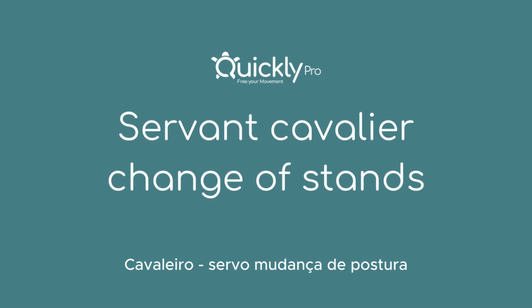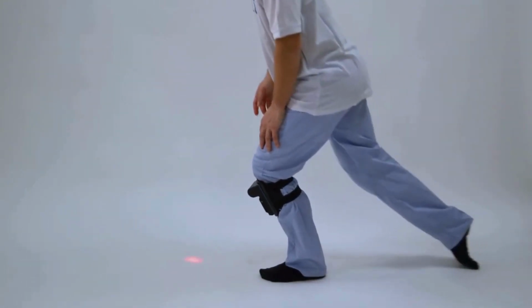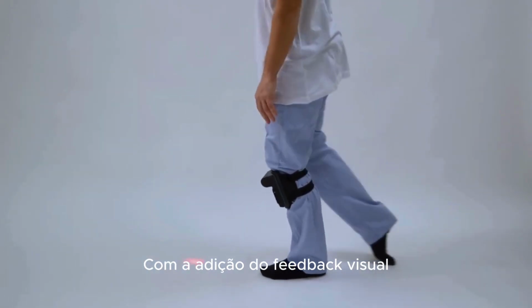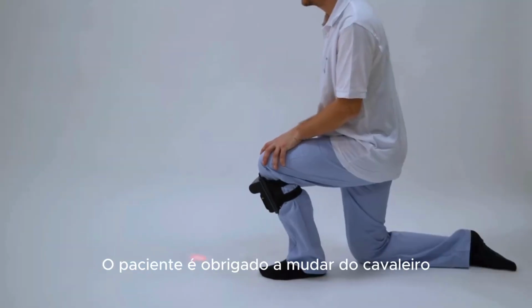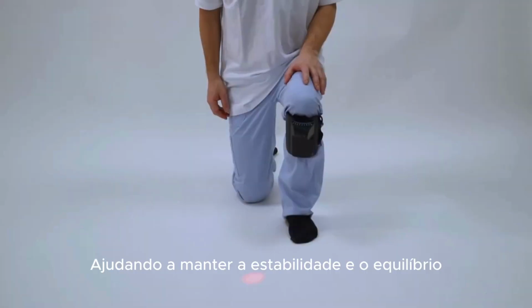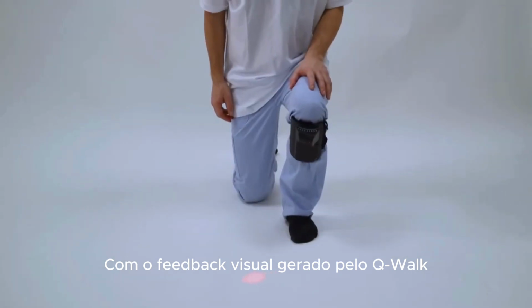Cavalier servant, change of stance. It is the classic posture change exercise with the addition of visual feedback. The patient is required to switch from the cavalier servant position to the upright one, helping to maintain stability and balance with the visual feedback generated by Q-walk.